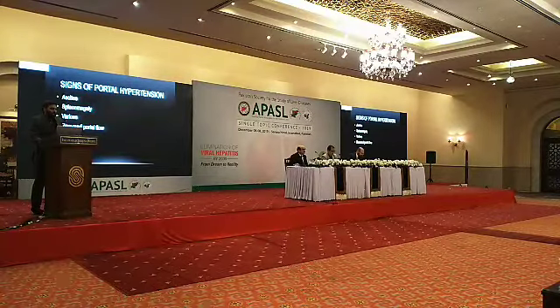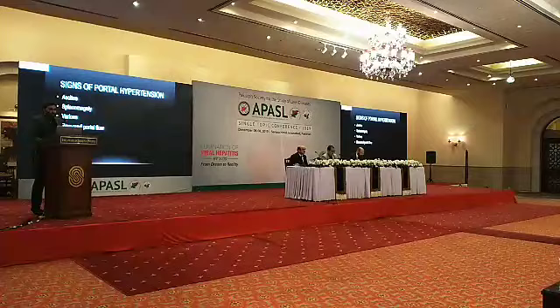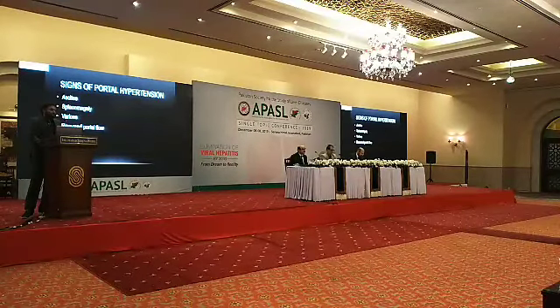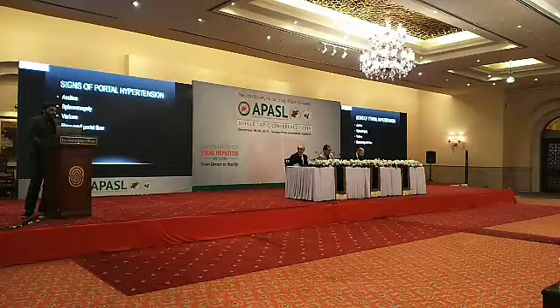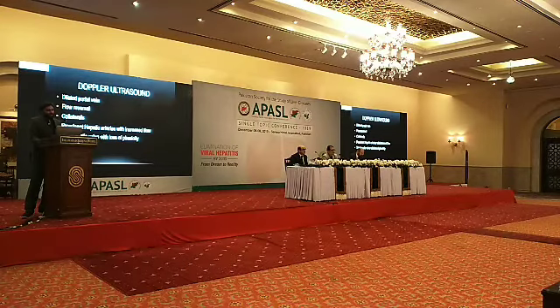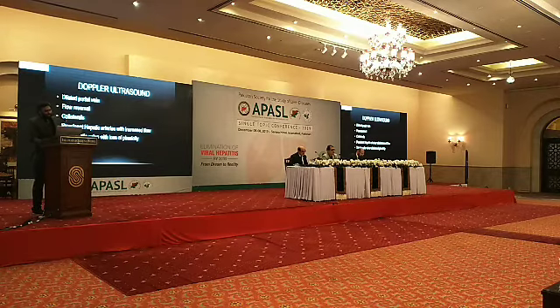and the last point, reversed portal flow. Now, when you order an ultrasound for cirrhosis, this is a point which we as radiologists usually do not look into. We don't see the portal flow. So if you are not getting that information, I think you should ask for it from your radiologist once you get the report. Doppler of the portal vein, flow reversal, the collaterals, the prominent hepatic arteries with increased flow is another sign, and hepatic veins which are thin, with loss of phasicity in them.